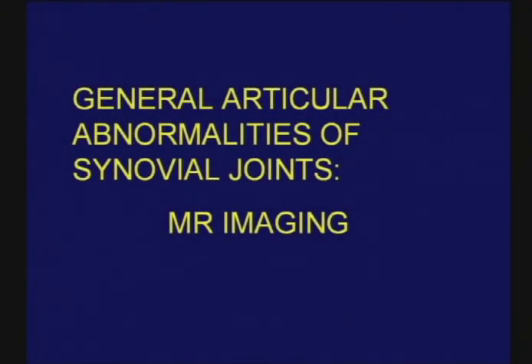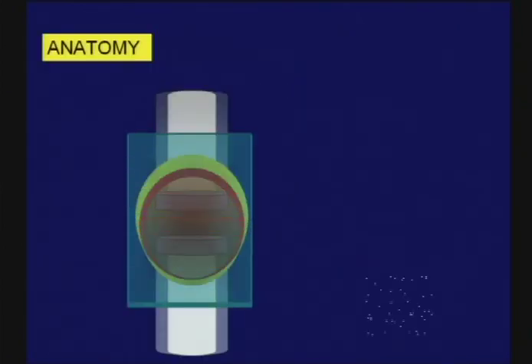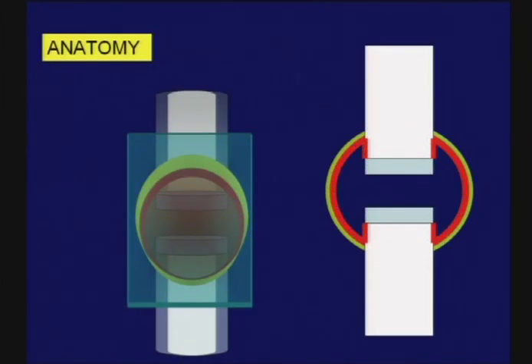I'm going to begin this morning's program by spending about 55 minutes giving you an overview of how MR imaging can help us as we try to sort out a number of processes that involve synovium-lined articulations. So as always, let me start with some general, simple anatomy.